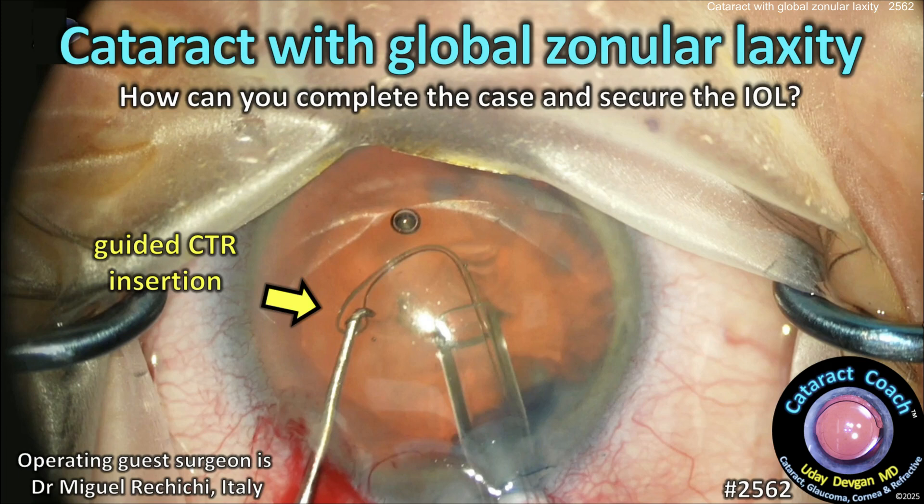CataractCoach.com. Cataract with global zonular laxity — how do you complete the case and secure the eye?